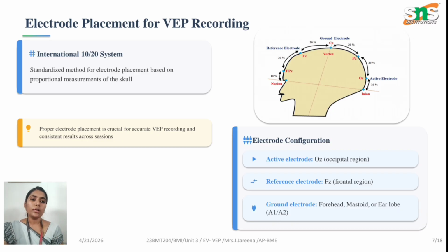Let's move on to electrode placement of visually evoked potential. Here also we are following the international 10-20 electrode system.